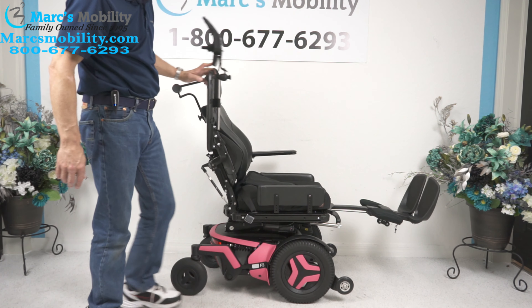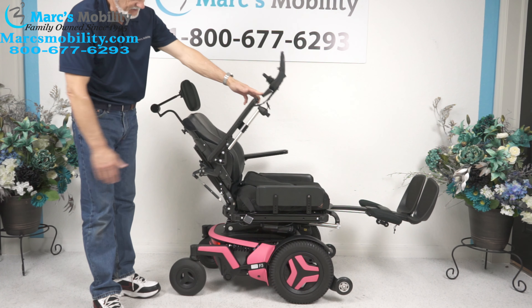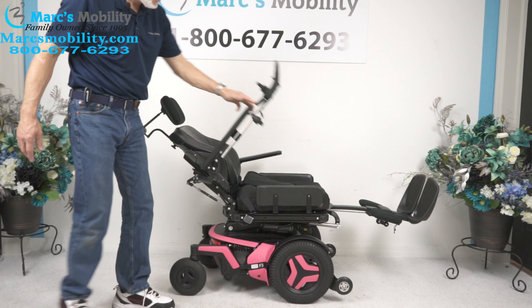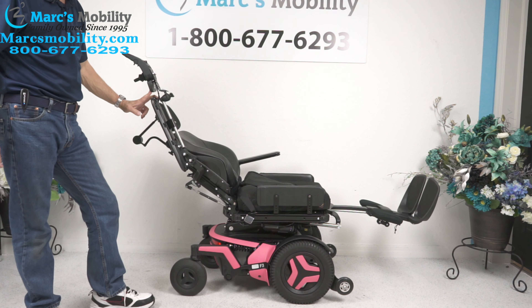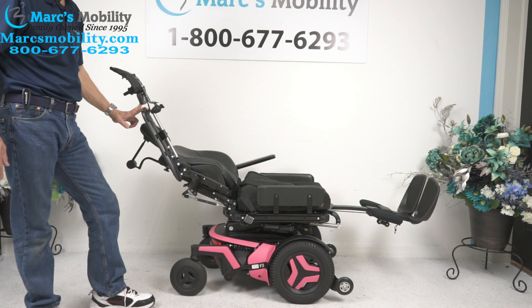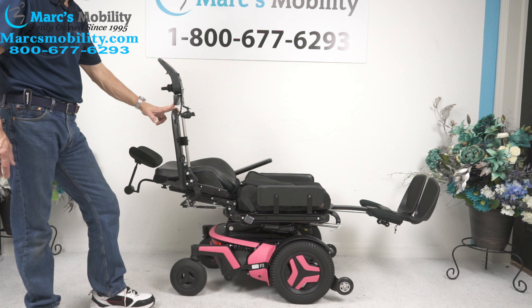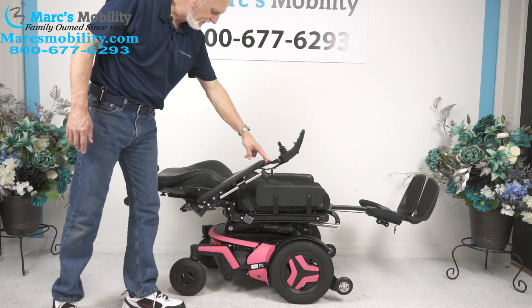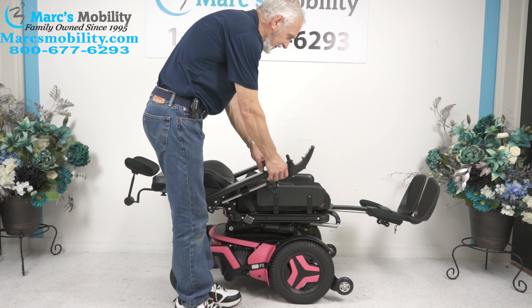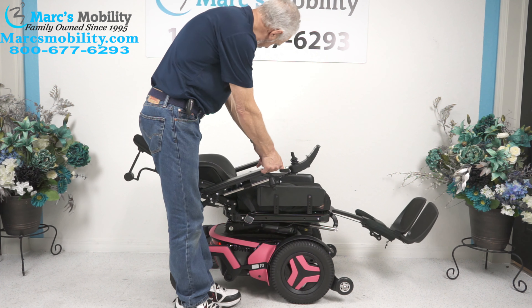The next function is called the electric recline. The electric recline is when your back right here goes back by itself — I'm holding the button, but this is called your electric recline. It's a full recline — you're going to be laying flat in this chair with the seat all the way down. I'm going to bring the recline and the legs back in. The legs are going down and the back is coming up.